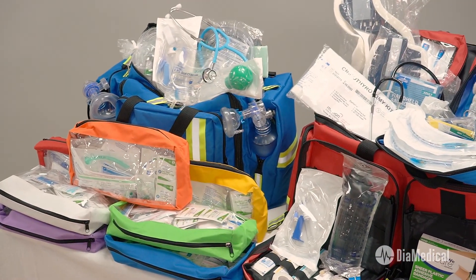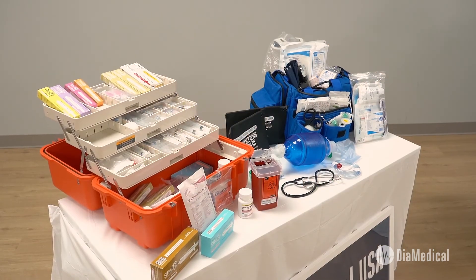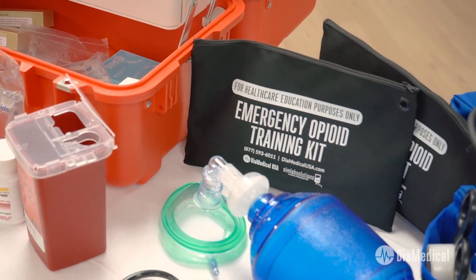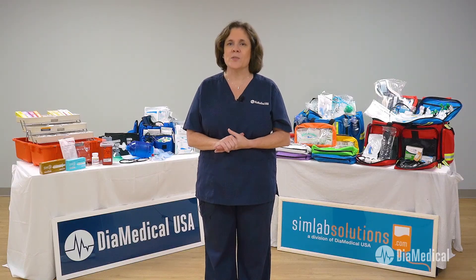Hi! Today we'll be highlighting our Loaded EMS Jump Bags by SimLab Solutions. These bags were created to promote best practices in a wide variety of emergency medicine scenarios. Each bag arrives loaded with all of the supplies and simulated medications required to practice life-saving procedures with both children and adults. Now let's take a closer look.